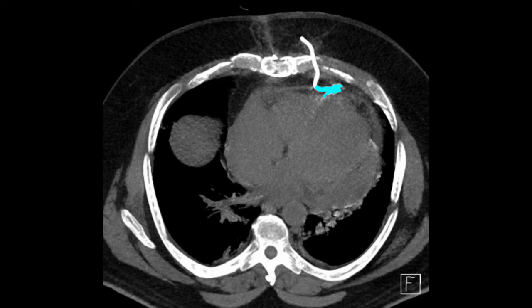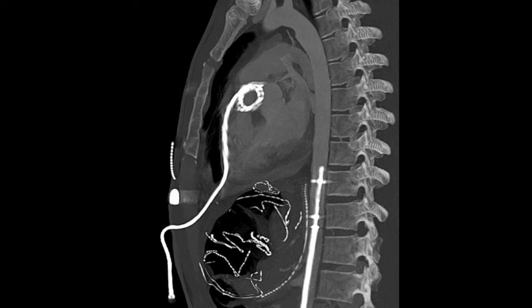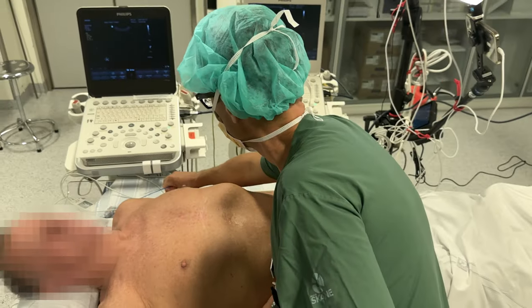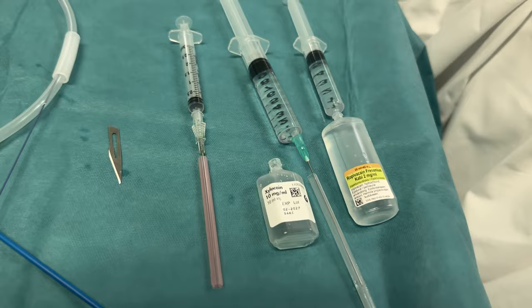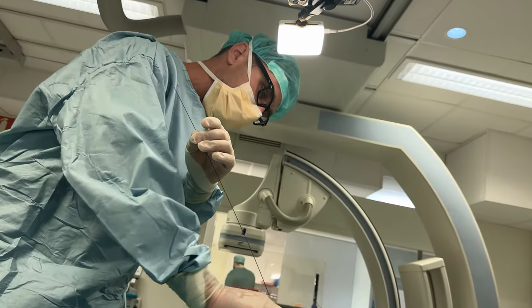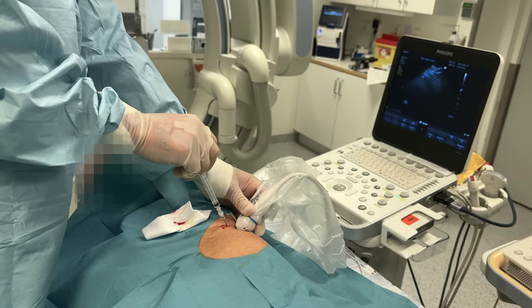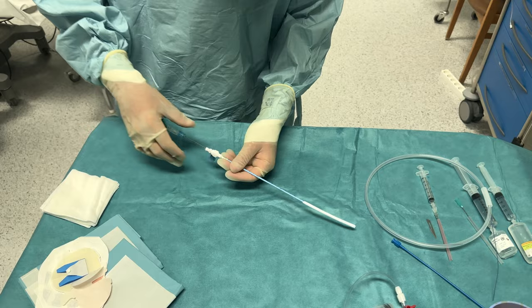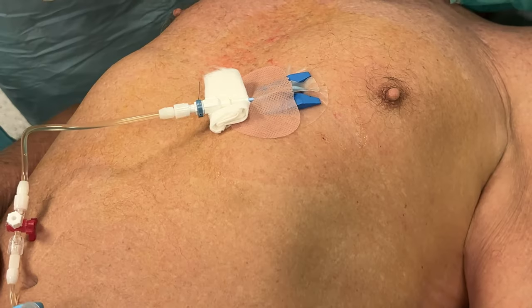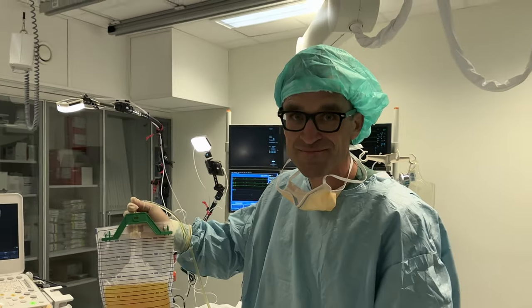The following images contain examples of sub-optimal tip placements. All these drains were placed using the sub-xiphoid approach. Often, a different approach could have been used instead, resulting in better tip placement. In one case, the drain is too ventral, leaving some dorsal fluid along the left ventricle. One patient had a gunshot wound to the abdomen and was packed with gauze after an exploratory laparotomy — the sub-xiphoid was clearly not the best approach. Ultrasound-guided pericardiocentesis is a superior option to traditional fluoroscopy-guided cannulation. It requires profound in-plane cannulation and Seldinger skills, but this is already part of the intensivist skill set if you're an expert on central lines and thoracic drains. Plan the logistics thoroughly and discuss backup plans with cardiothoracic colleagues if there are complications. Feel free to reach out through interanus.org if you have questions or want to invite us to hold a workshop in ultrasound-guided procedures.